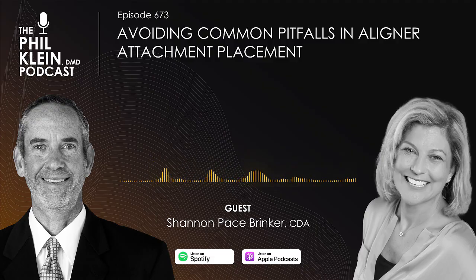Do you do the whole arch, or do you do 3 or 6 teeth at a time just to ensure good isolation and control of moisture?